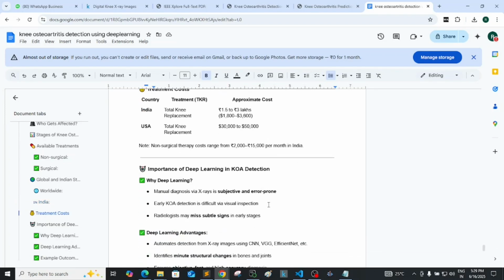So now in this case, how will deep learning help? As you see in the above classes, there are 5 different stages, and the 5th stage is causing so much of an issue. So what if we can properly detect and analyze the stages at the initial stage of the disease? We can treat it with less cost, and the cost of treatment will be very low.